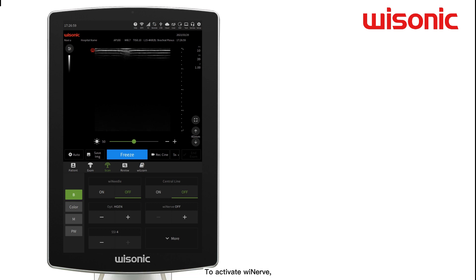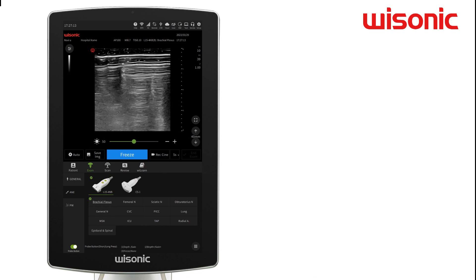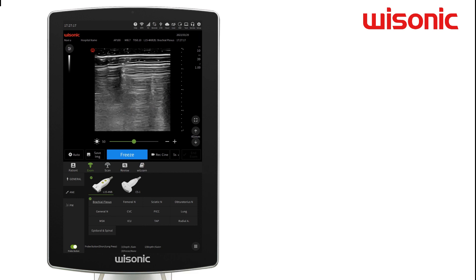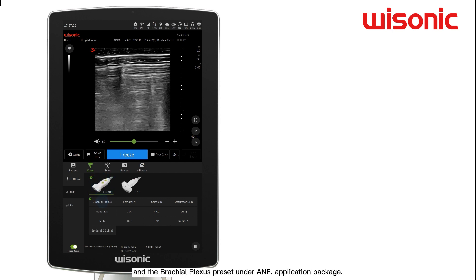To activate wiNerve, select the specific transducer and preset first. For example, to get access to the Brachial Plexus approach, select the linear array probe and the Brachial Plexus preset under the Anesthesia Application package.